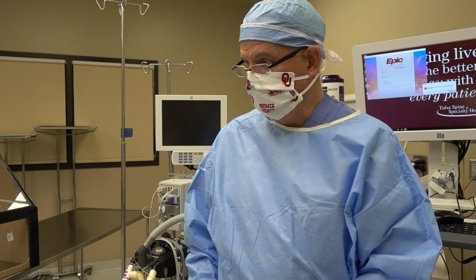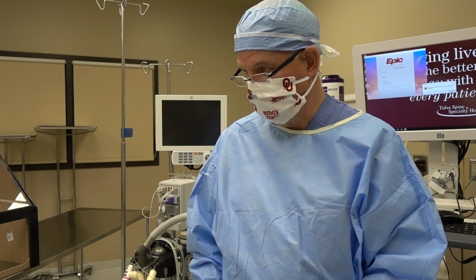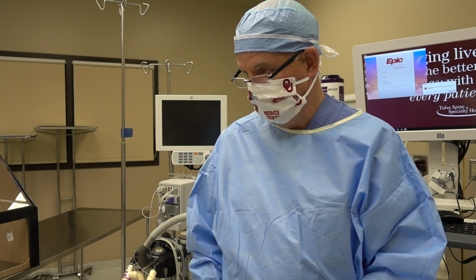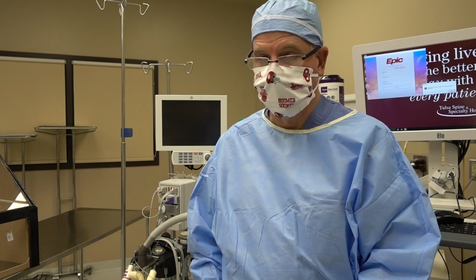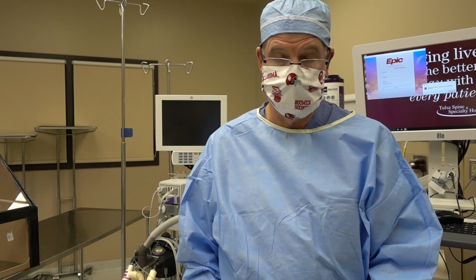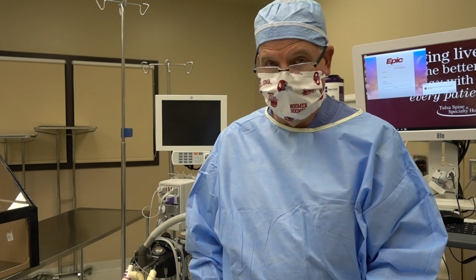I'm going to be going over some aerosol containment equipment that I've designed, hopefully that will help people and keep the viral load down in the operating room or anywhere where there's intubation or extubation being done.